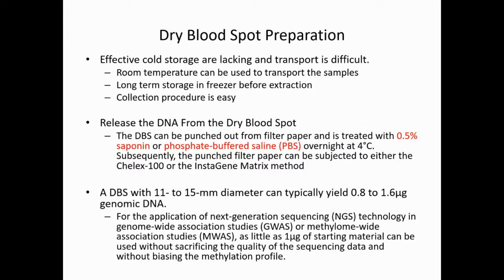And furthermore, the DBS can be collected from finger sticks, or heel sticks, like for infants and young children. So this blood collection procedure causes minimum risk to the participant.